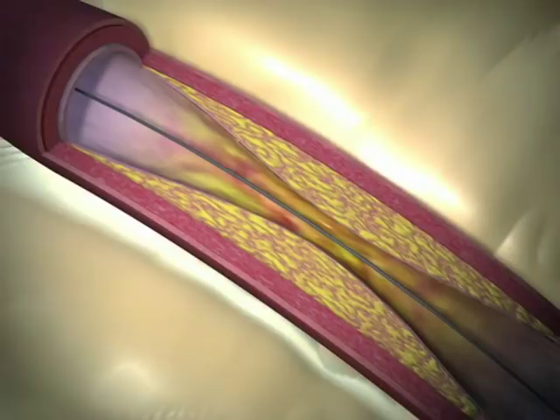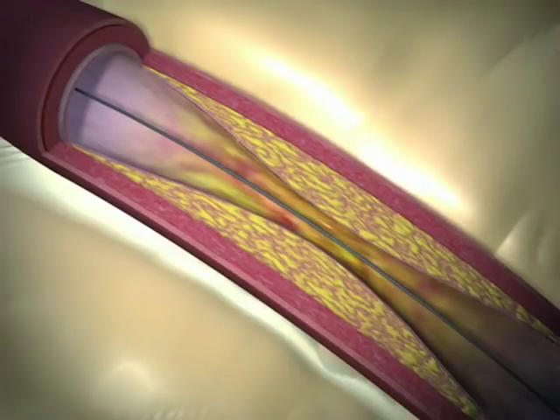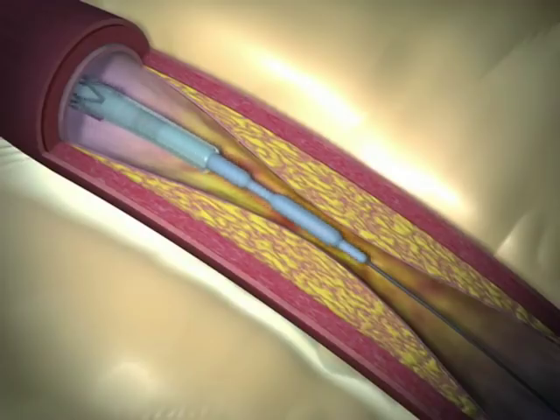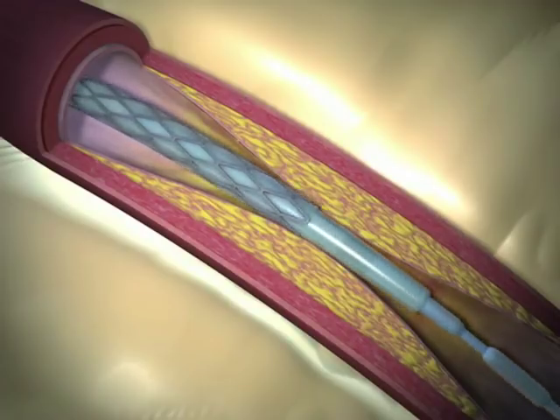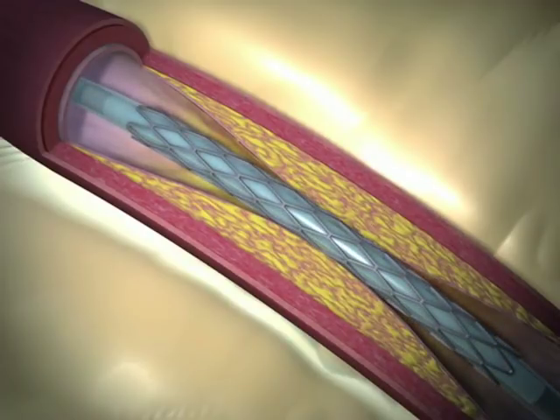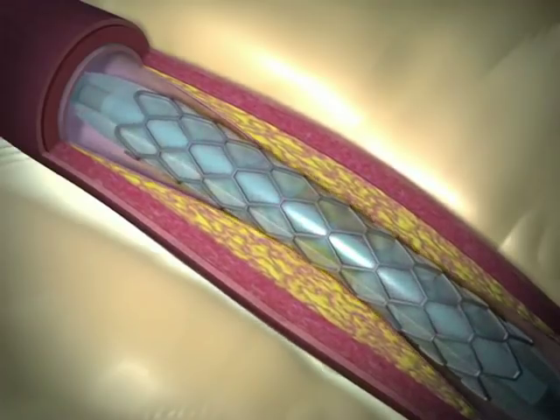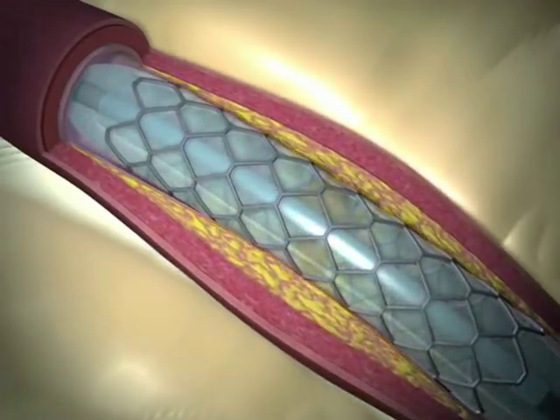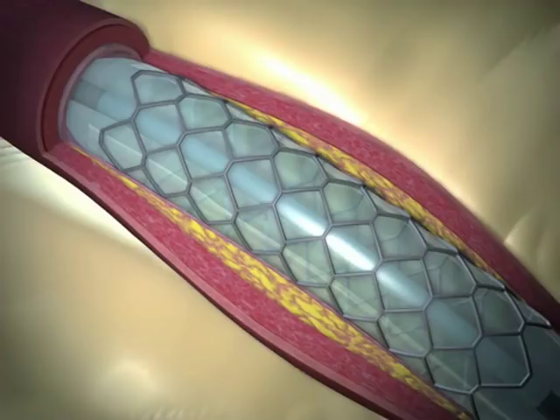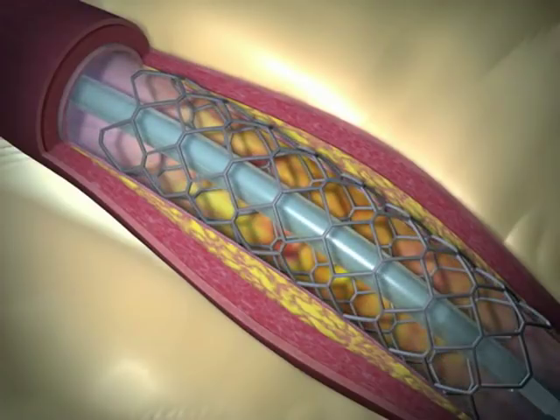After aspiration of the thrombus, a stent is passed directly across the residual obstruction over the existing guide wire. Stenting is performed by deployment of the stent by inflation of the balloon delivery catheter. The balloon delivery catheter is then deflated and removed.